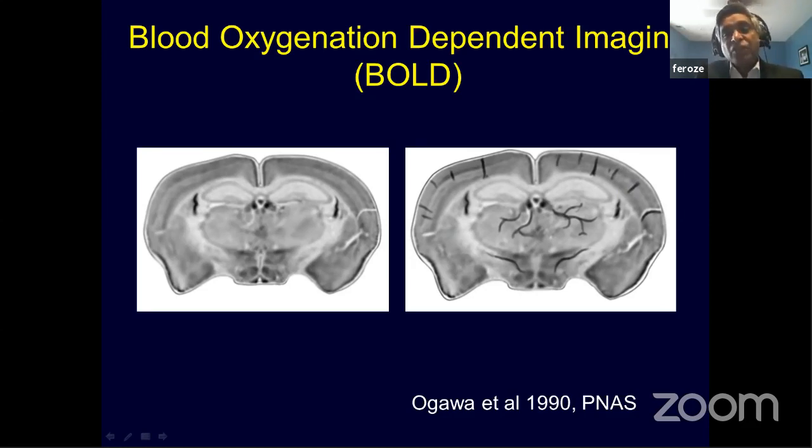So he came up with a theory that this decrease in signal intensity might be because of the presence of deoxyhemoglobin, which we know is more paramagnetic, and coined the term BOLD, blood oxygenation level dependent imaging. It could be because of the blood oxygenation that you're able to see this contrast, as we all know in radiology how important contrast is. But the important thing is it's a negative contrast, right? BOLD imaging creates a negative contrast in this case.